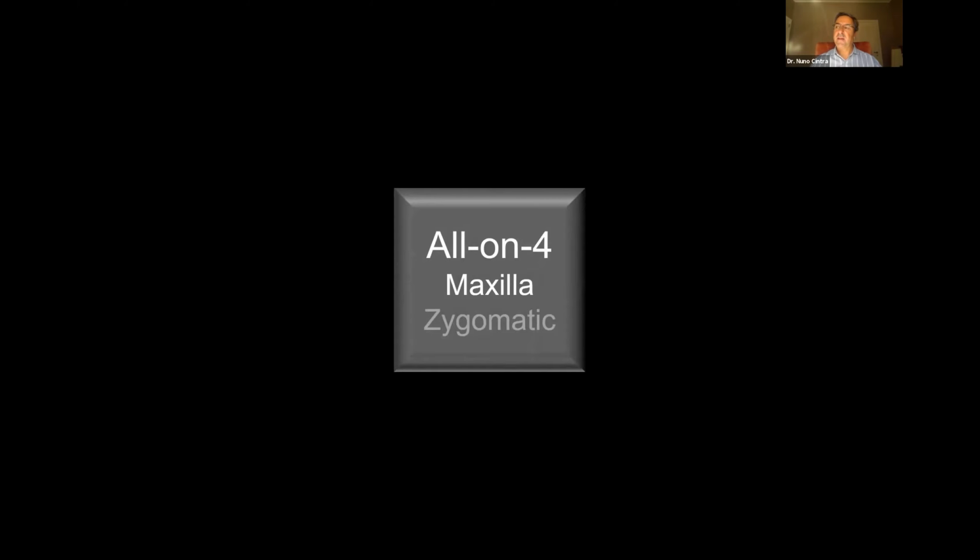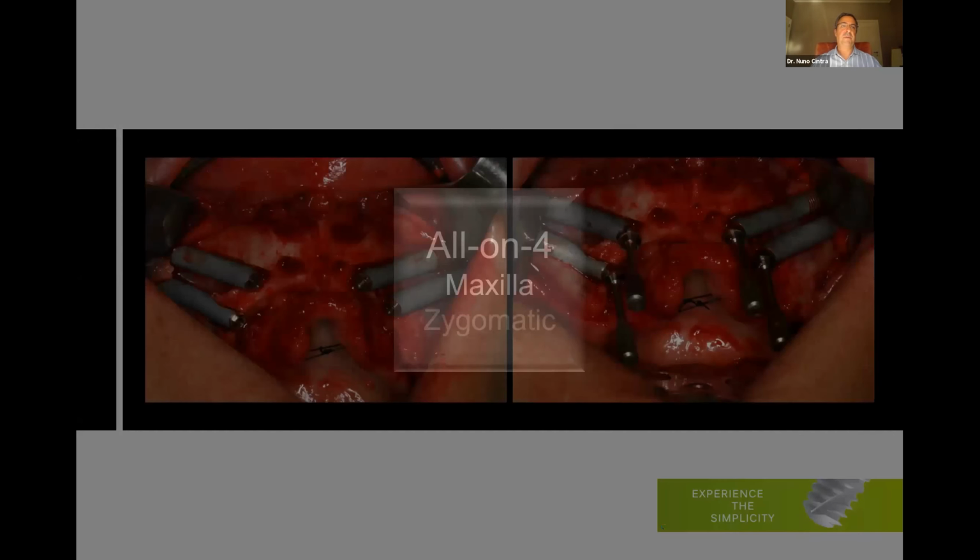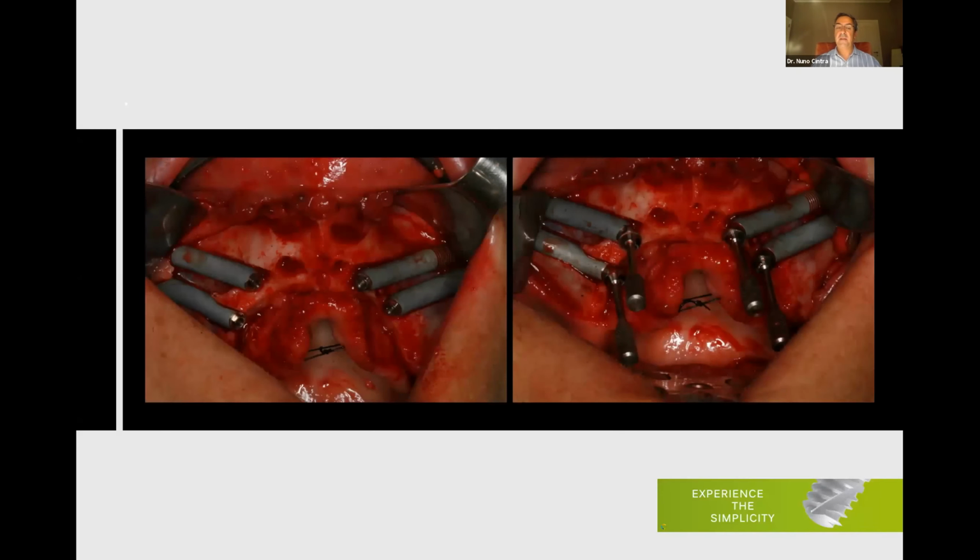Now, talking about zygomatic implants, I'm not very keen on zygomatic implants. There are studies showing more than 90% success rate with zygomatic implants, but this is a technique that, in my opinion, if you only get 6 or 8 cases per year, you'll never be good at it. If you get 60 or 70, yes, you're going to be good at it. But I don't get that many cases that need zygomatic implants.